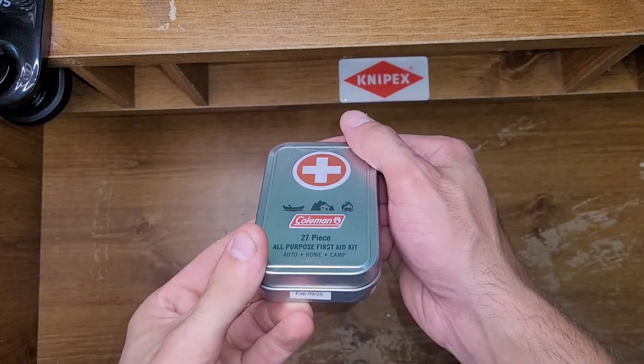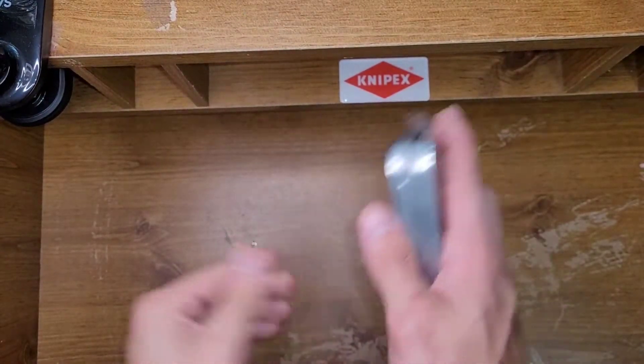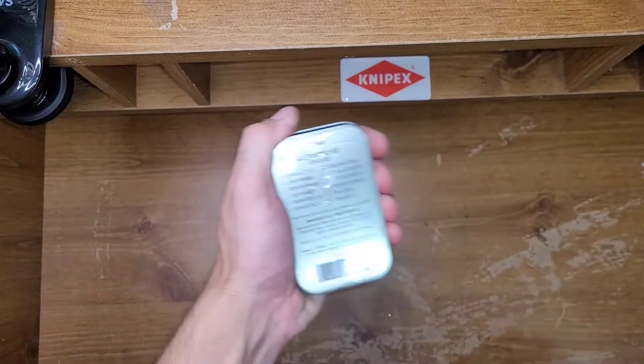Welcome back to Mainly Everything, my name is John. Today we're gonna be looking at a Coleman 27-piece all-purpose first-aid kit. This thing's tiny — that's why I bought it.